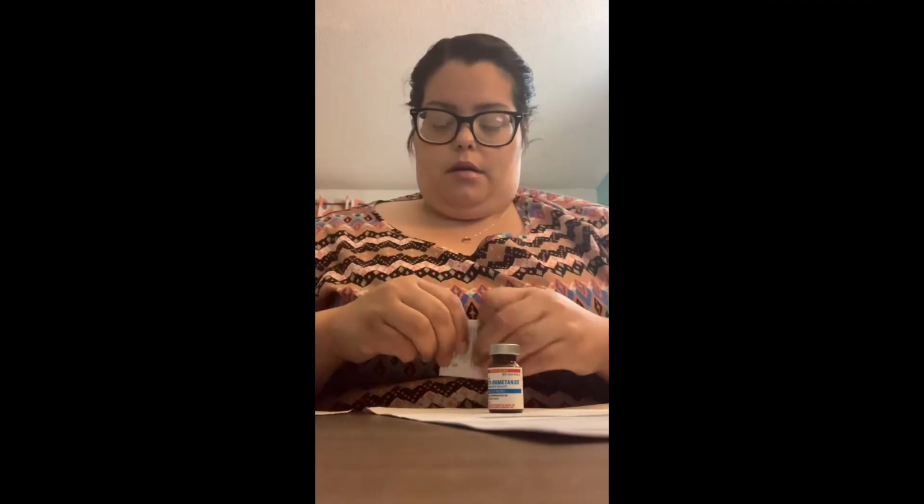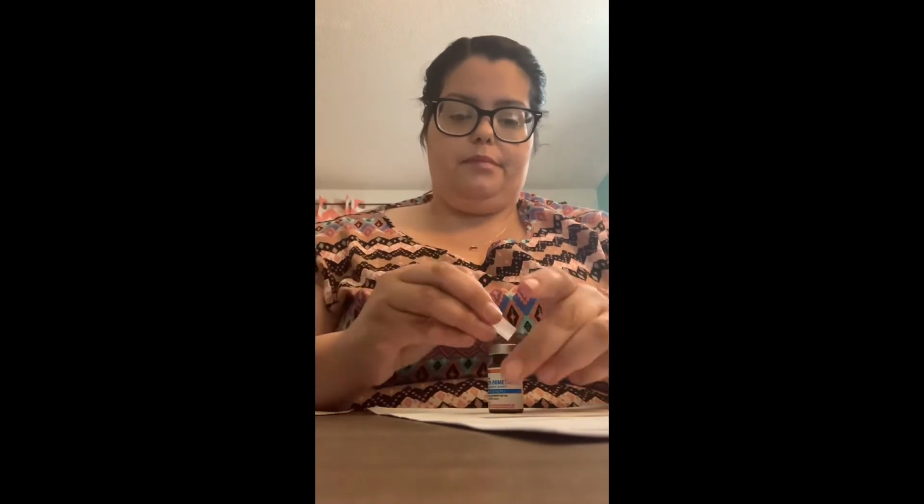So we have the medication. We will now take off the cap. We're going to clean our hub in a circular motion. We also have our syringe with our needle connected, so we will open that.